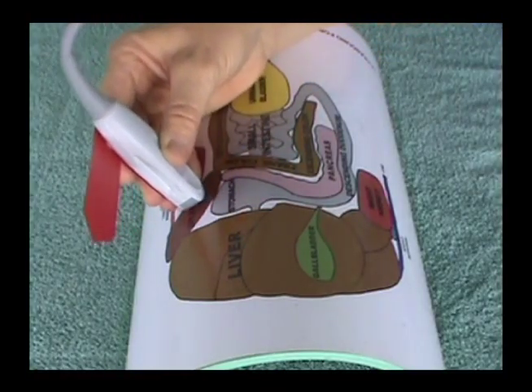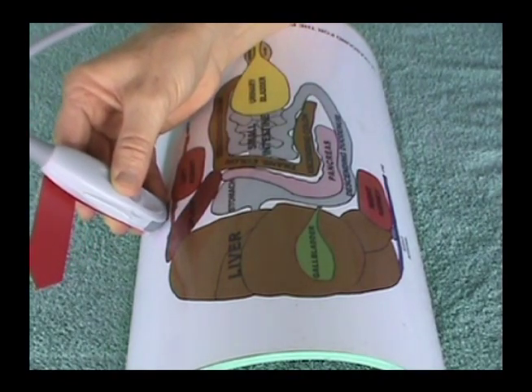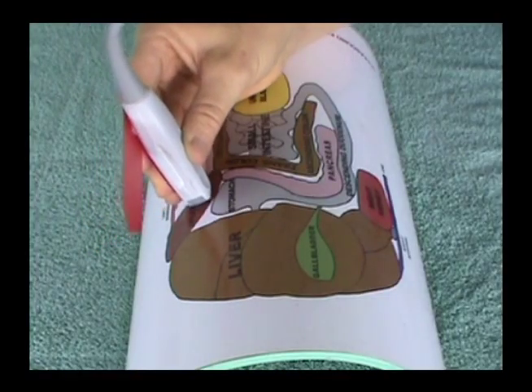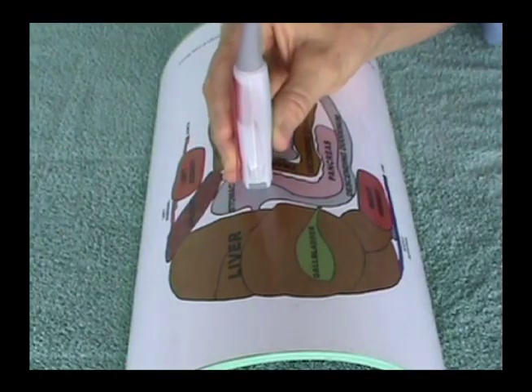Note that all directions and instructions are given in relation to the transducer's movement on the patient's body. Move to the patient's left or right, not your left or right.